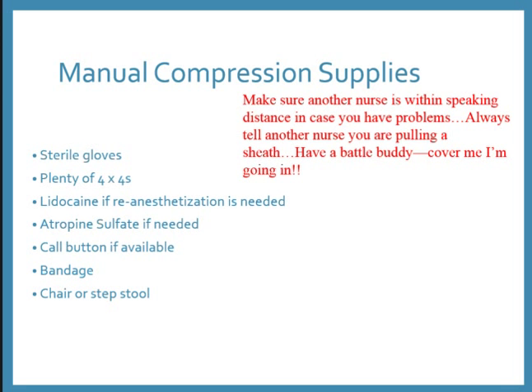And the other reason you tell somebody else you're going in: if you're holding pressure and your patient becomes bradycardic and hypotensive, are you going to quit holding pressure to give that atropine? I mean, if you can give the atropine one-handed, mad props to you, but I'm not that skilled. So, other things: sterile gloves. Yes, you are supposed to use sterile gloves. Sterile 4x4s, and I always have a gaggle of 4x4s just in case I get a bleeder.